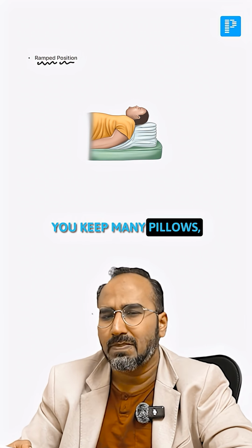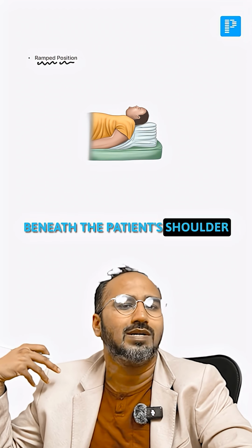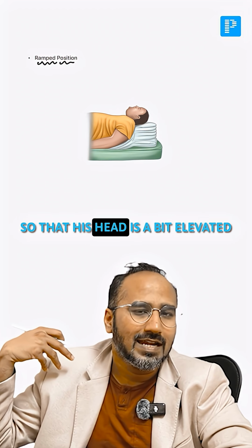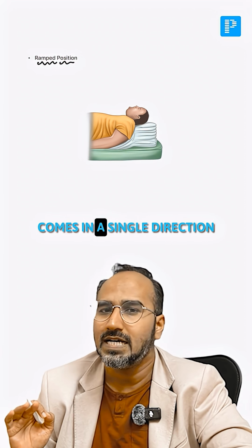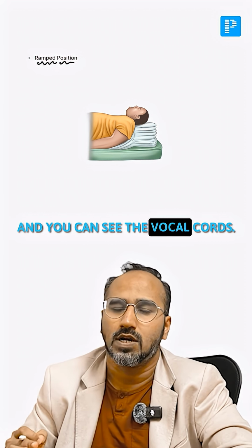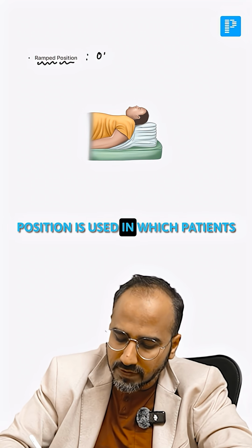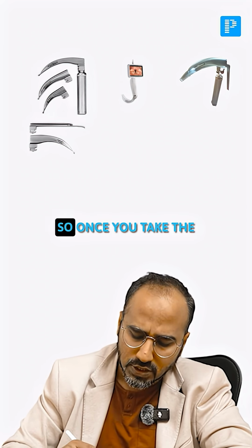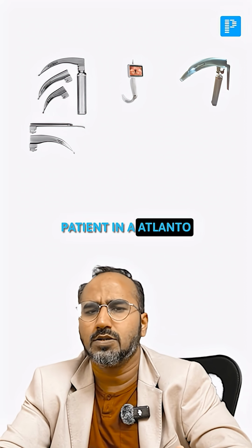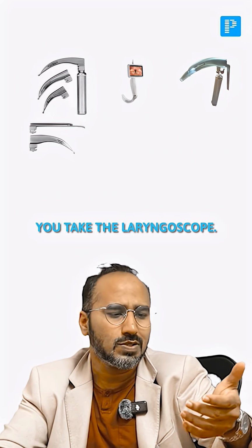You keep many pillows or many things beneath the patient's shoulder so that his head is a bit elevated, so that his oral and pharyngeal axis comes in a single direction, and you can see the vocal cords once you put the laryngoscope. So this ramped up position is used in which patients? Obese patients, we use a ramped up position. So once you take the patient in a sniffing morning air posture, you take the laryngoscope.